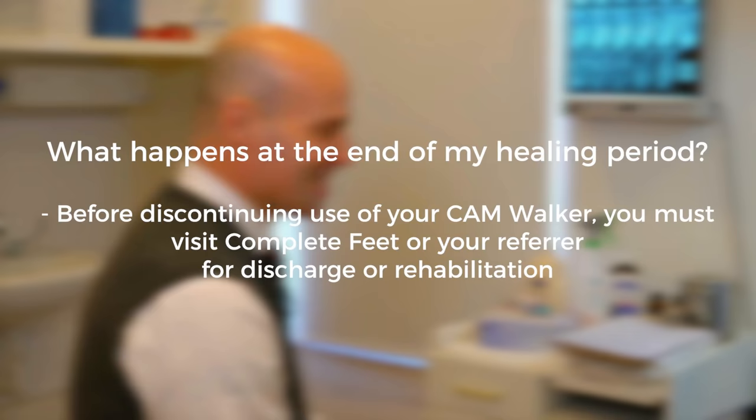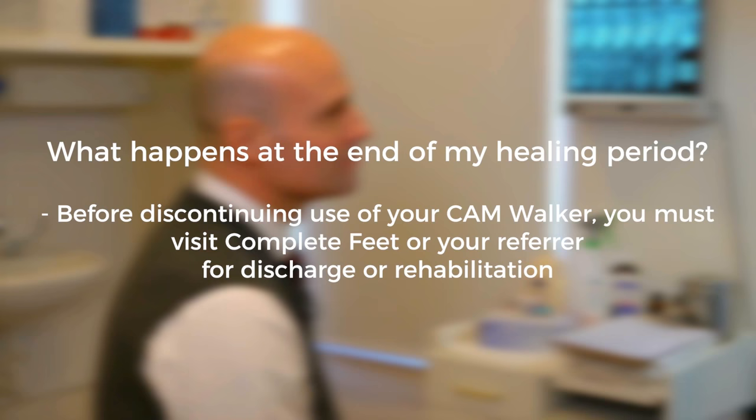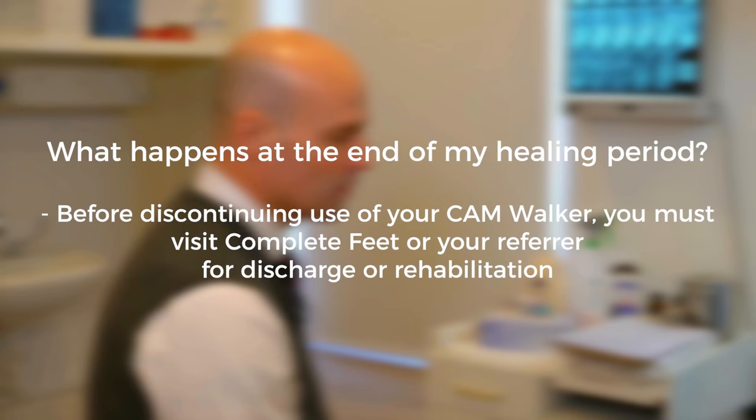What happens at the end of the healing period? Before discontinuing use of the walker, you are required to visit Complete Feet or your referrer for discharge or rehabilitation. Often an x-ray and examination is required to gauge if sufficient healing has occurred.